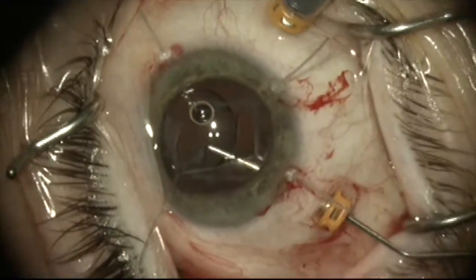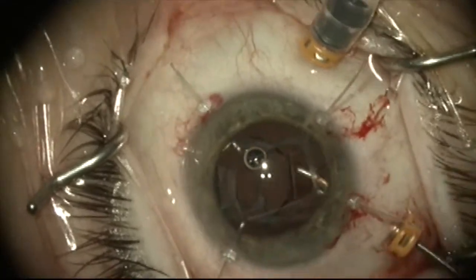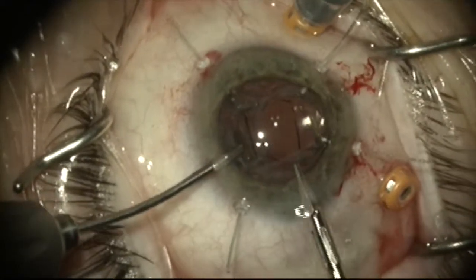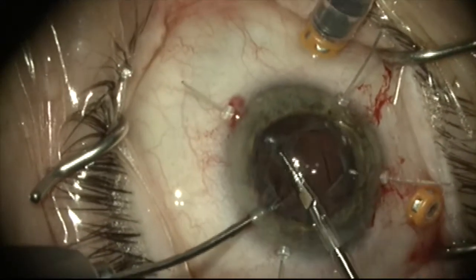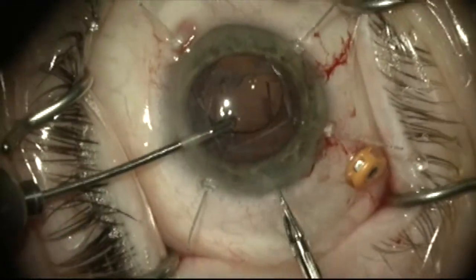After the anterior capsule is stabilized and expanded with the iris retractors, a cyclodialysis spatula is placed through the pars plana. I can now grasp the optic of the lens with the forceps and cut the hinges with a micro scissor without having to worry about damaging the anterior capsule rim.